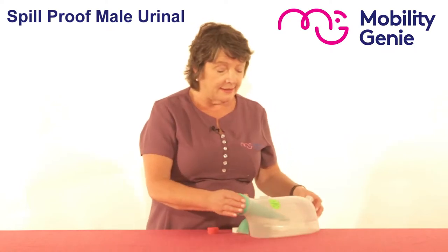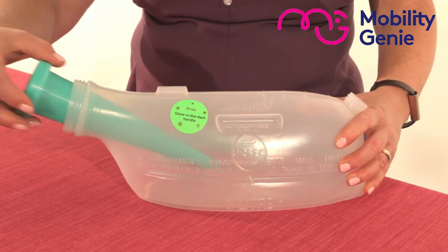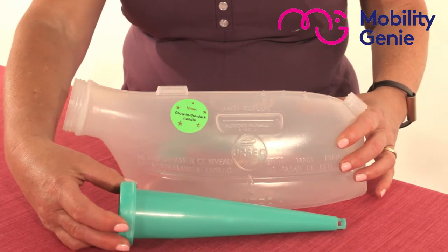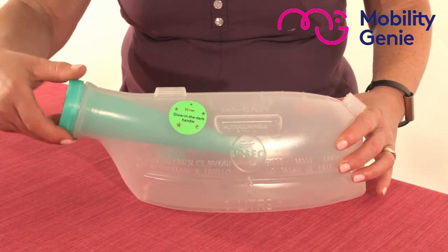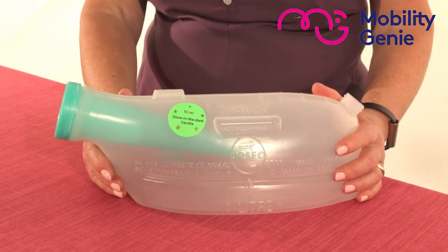It is specially designed with an anti-reflux part to it, as you can see there. Because it's anti-reflux, it won't allow what's in it to escape. Therefore, when I screw that on, you don't even need a lid. This can even be left in the bed where it's instantly available to the user.